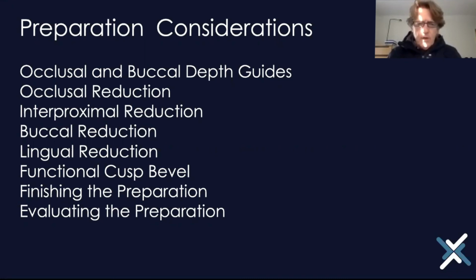If you have the ultrasonic tips, you can finish your prep with ultrasonic. That gives you a really nice scannable surface. So remember what we spoke about in the level that we're rebuilding 3D surfaces and reconstruction via algorithm.